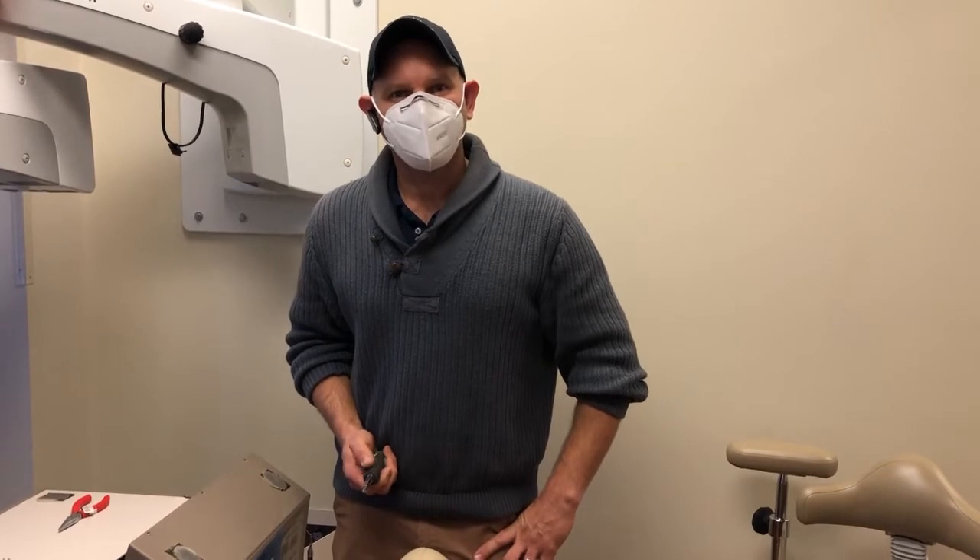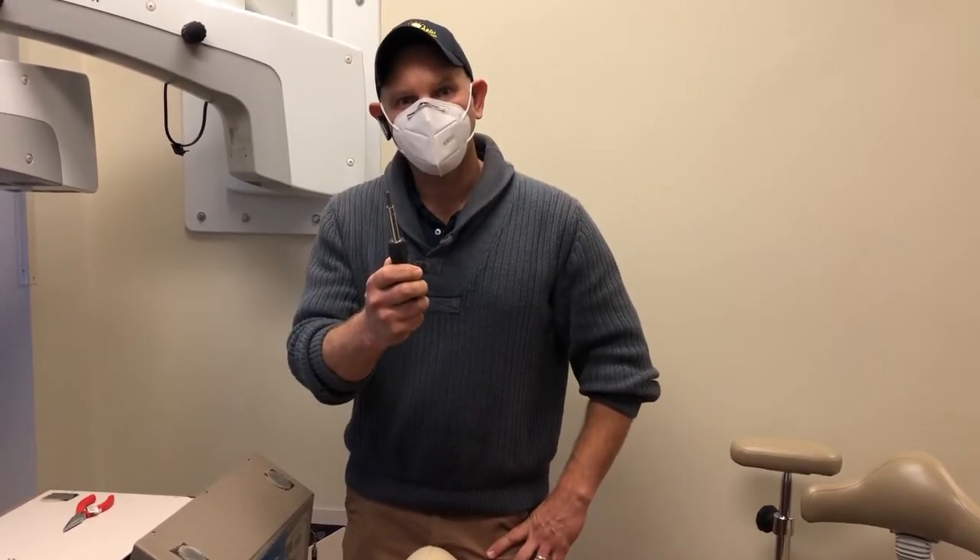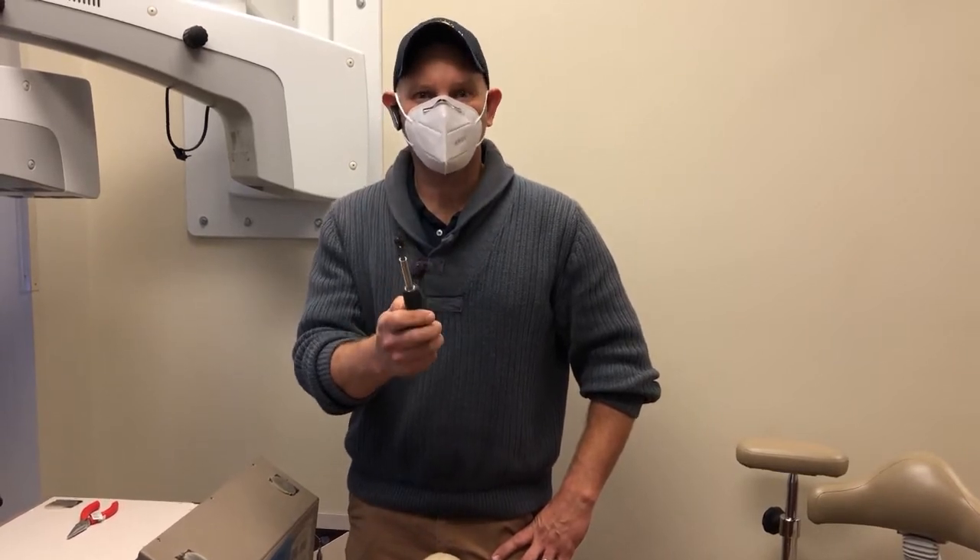Hi, I'm Jason from Bright Idea Dental Repair. Today I want to give you a quick tip. You might recognize this as a screwdriver, but today I want to show you an extra feature that you might not be aware of.